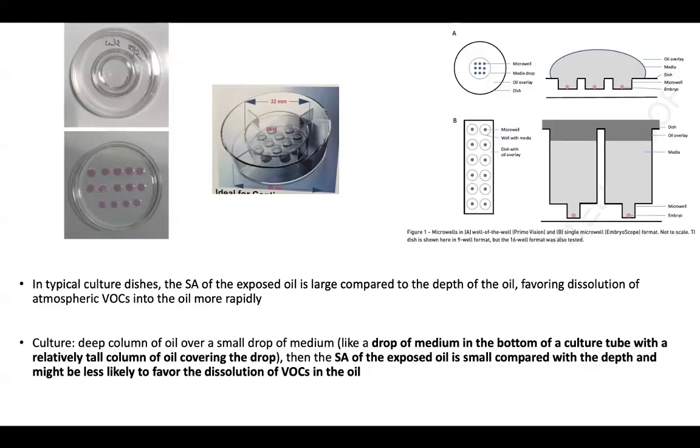culturing. As the surface area of the exposed oil is smaller compared to the depth of the media and the oil. So these dishes are preferred, or else if you're using normal dishes, you have to cover with a very thick layer of oil.